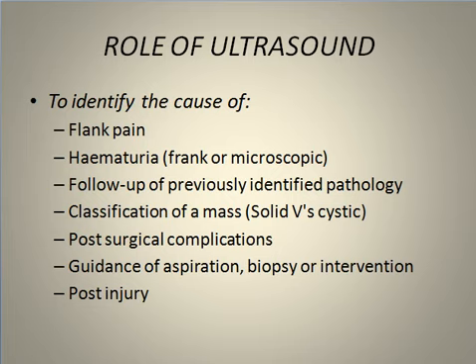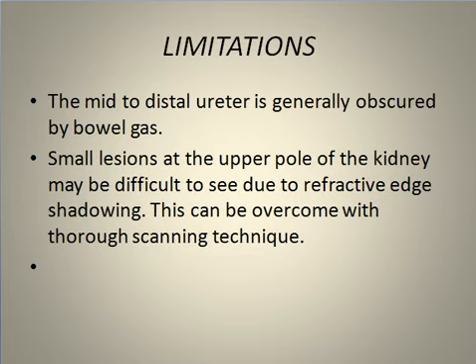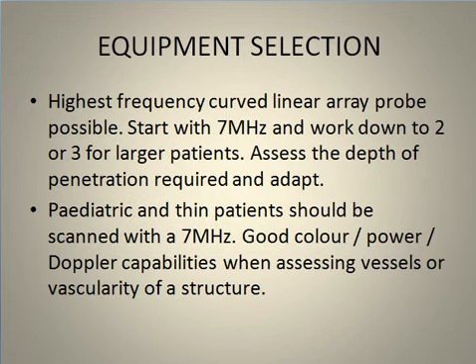There is some limitation in identifying the ureter, and there is also some limitation in the upper pole mass lesion seen due to refractive edge shadowing.